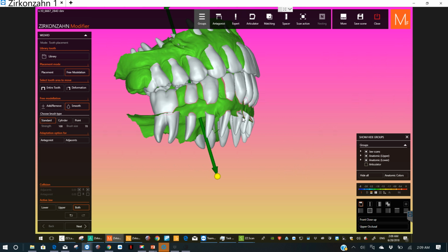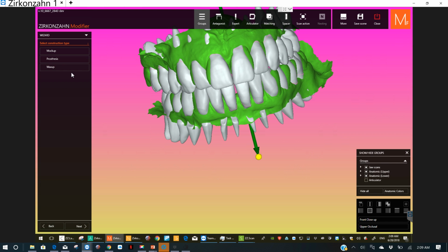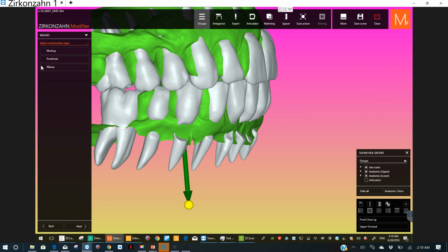Okay, so mock-up. Now we're not done yet, so now we go to next. What we could do, make sure that the bite's nice, but let's go to next. And you can pick what you want to do here. So if you want to do a wax up, it would just blend those with it and make you a model that you could print, and then you can make a putty matrix of that. That's what a wax up is. So right there, I would just click wax up, boom, and you could print the combo of these, which is cool. You could go remove those areas if you wanted.